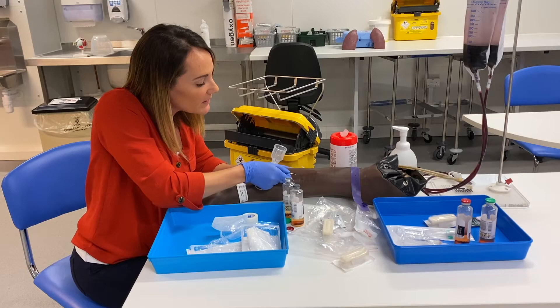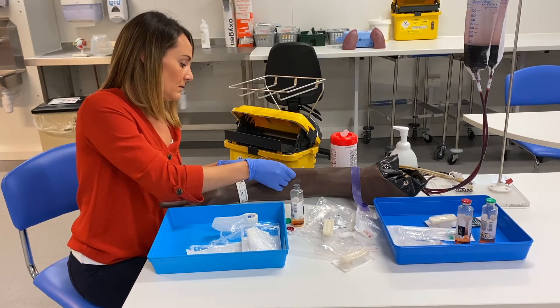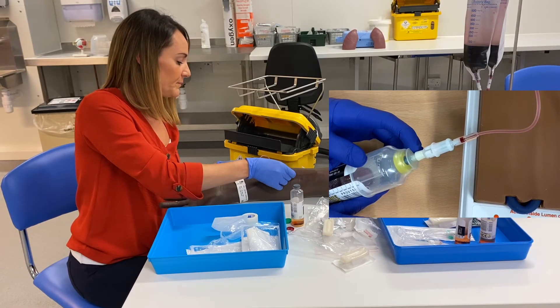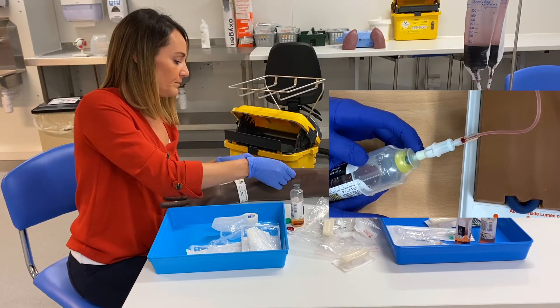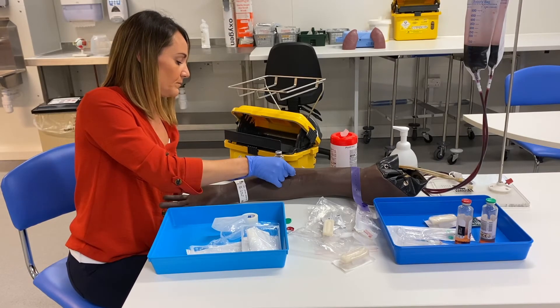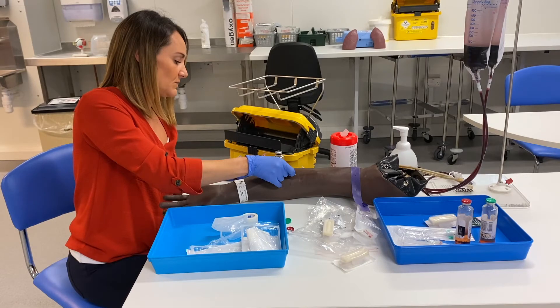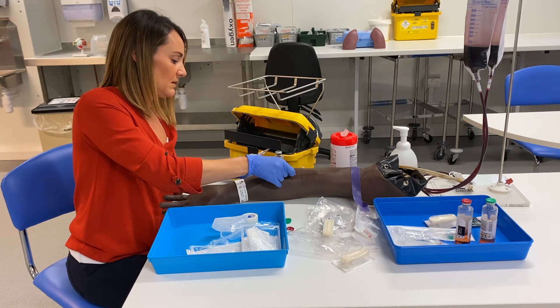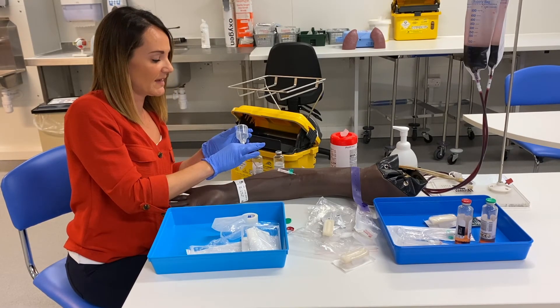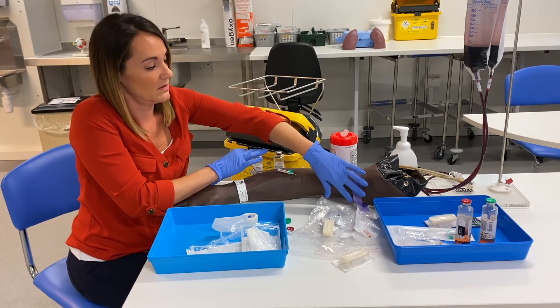Insert your needle — there's a bit of pressure there. Put your aerobic bottle in first, bring the bottle down. Fill it up for about 10 mils — it's quite hard to see when you're filling up, so I count to 10 in my head. Then the second one — be very careful not to touch the top of that — bring it down. It's really important that you fill them nicely for about 10 seconds. Then disconnect. If you wanted to take some further bottles like U&Es or whatever you need, you can then disconnect your barrel. Bear in mind that in the middle — that's the sharps — that has to go straight into the sharps bin. If cultures are all you need, you can remove your tourniquet.